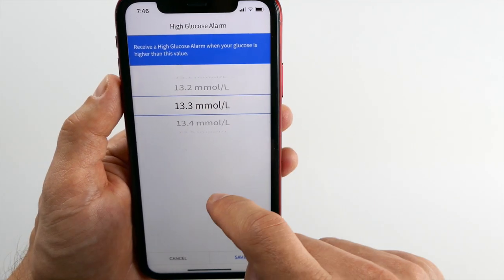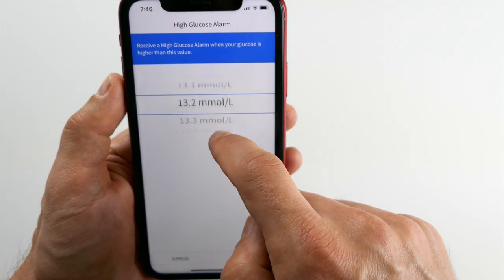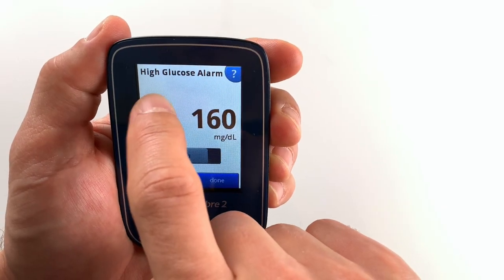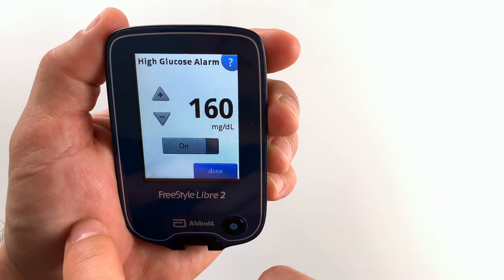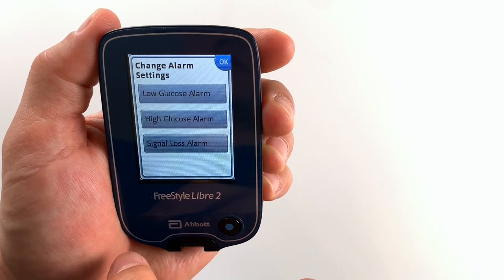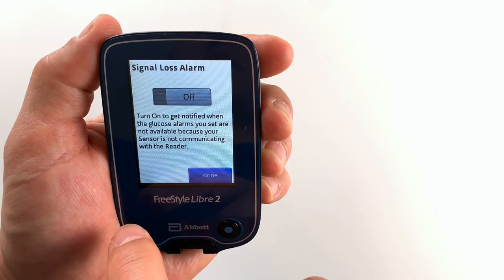By the way, you could see that I have different units of measurement on my phone, which uses millimoles per liter, and my reader, which uses milligrams per deciliter — because I bought the reader in Germany and downloaded the app in Switzerland. I can't change the units of measurement for either of them. So when getting the reader or the app, always try to do it in the country where you live because changing these units of measurement is really not possible right now.